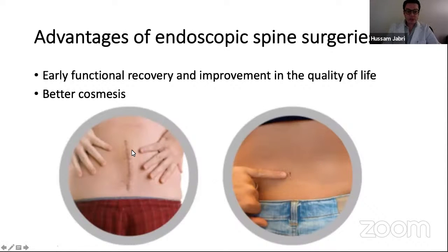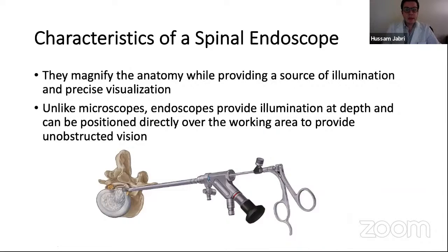As we see, the surgery in open techniques leaves a much bigger scar compared to the less than 1 centimeter scar and wound caused by the endoscope.